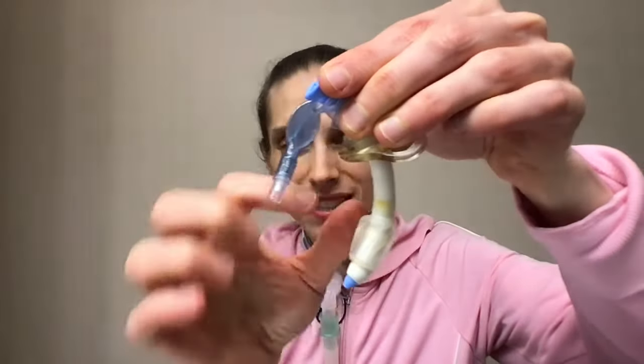And all the mucus that's inside is going to get pushed out onto this little tip. And you can take a little piece of paper toweling and carefully wipe off all that mucus. Now all the mucus is out of the tracheostomy tube. What can you do now? Put a little bit of lubricant jelly in there and reinsert the tracheostomy tube.